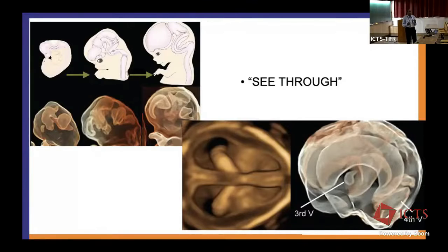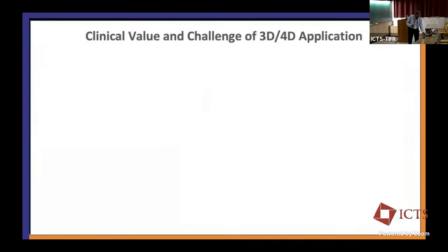For example, in intrauterine infection, some changes in the lateral ventricle are the ones which actually give me the diagnosis. And by understanding, confidently calling that this image is normal is what we are actually looking at. And if it flags off saying this image is abnormal, then we can always give information.